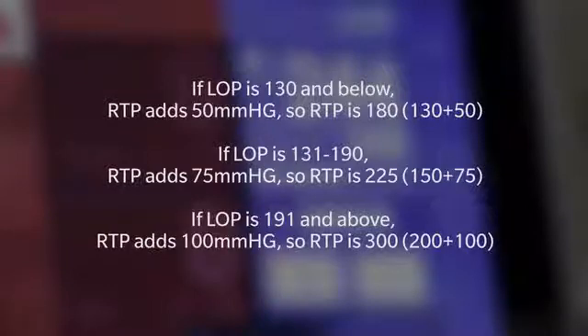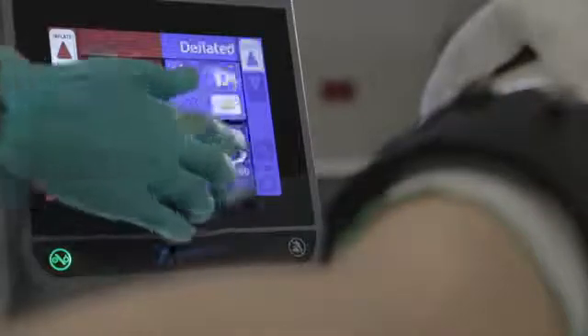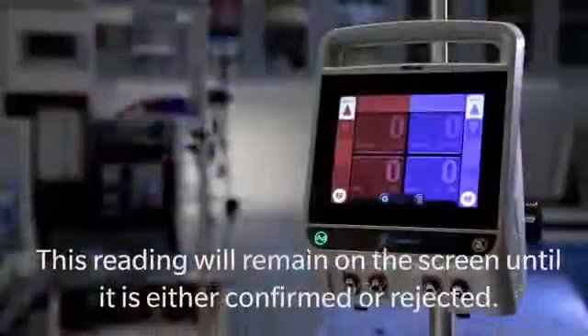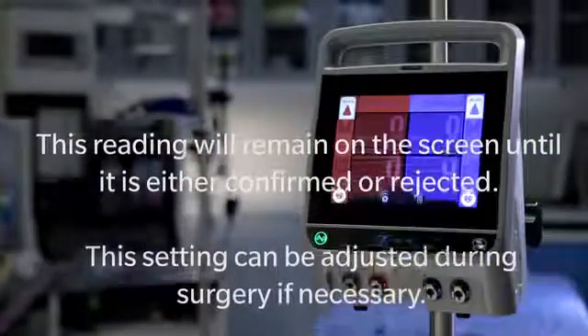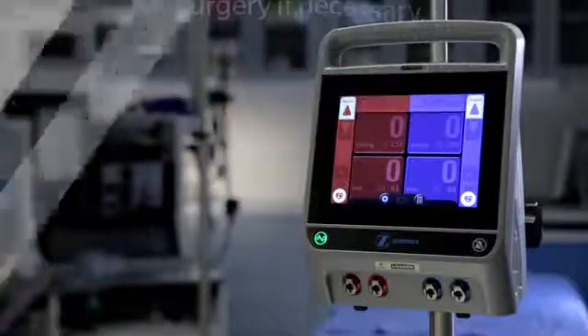Using the LOP reading, the unit determines the recommended tourniquet pressure, or RTP, expressed in millimeters of mercury. In calculating the RTP, the unit includes a pressure margin in addition to the limb occlusion pressure. This feature helps ensure that blood occlusion in the limb is complete even when blood pressure fluctuates during the surgical procedure. To accept the RTP, tap confirm and then tap confirm for the pressure tile. This reading will remain on the screen until it is either confirmed or rejected, and can be adjusted during surgery if necessary.